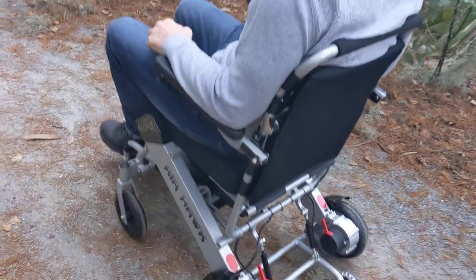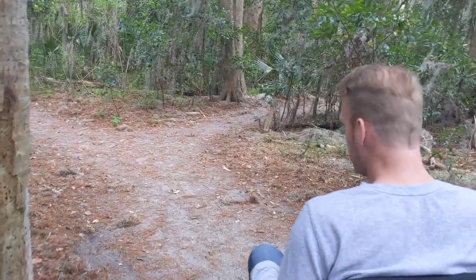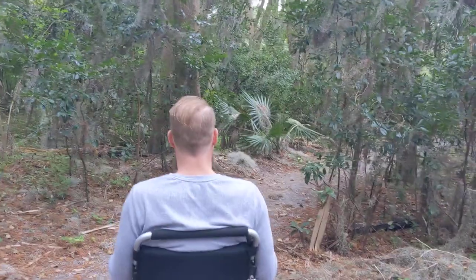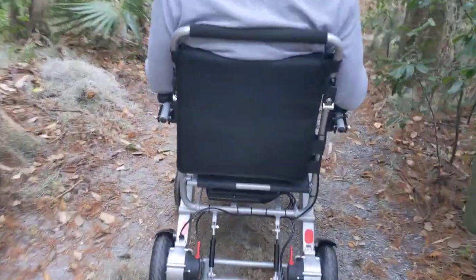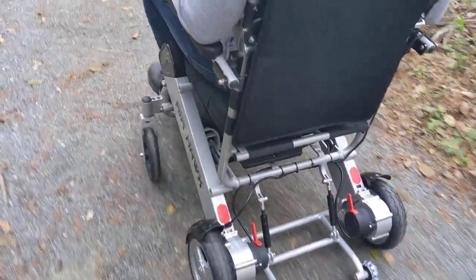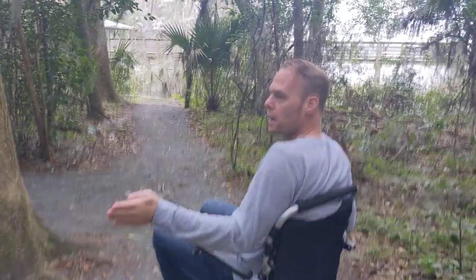We can see a little bit of the trail here — it's sandy, it's got moss, and a lot of beautiful plants. I've got a lot of different directions that I can go, and I can navigate with no problem at all. The chair can go pretty fast, and you can see how the terrain changes around here.